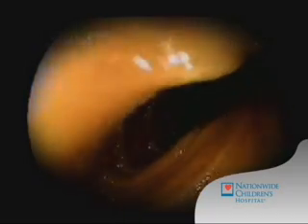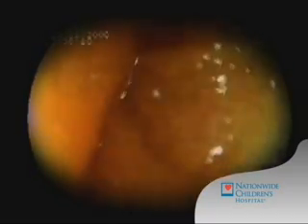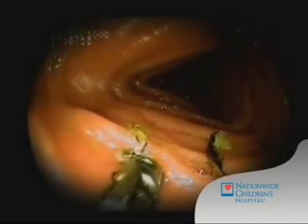We examine the intestine going both ways — both in and out — allowing us to double-check for possible lesions that we may not have appreciated on the way in.